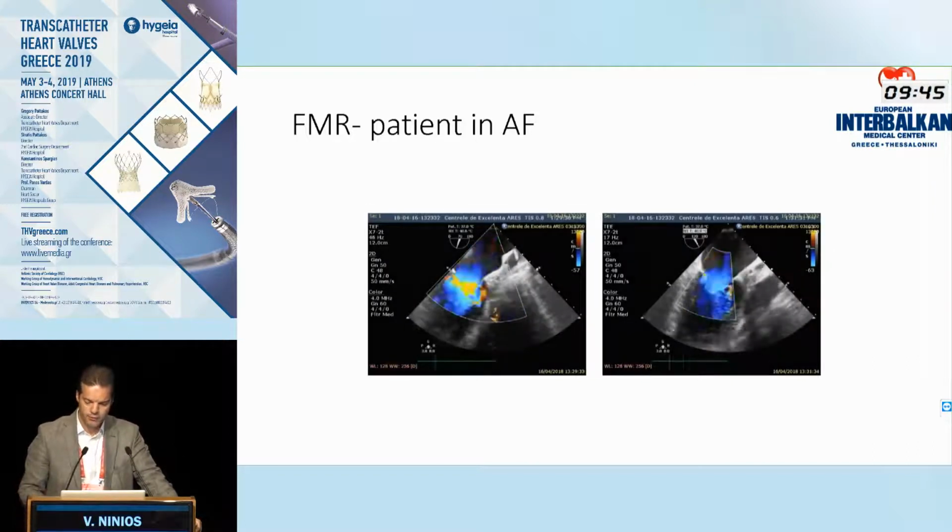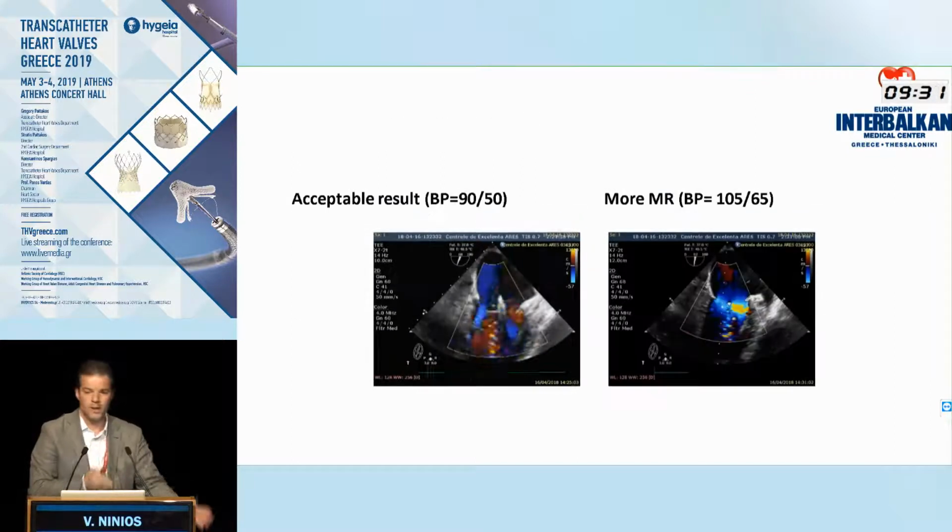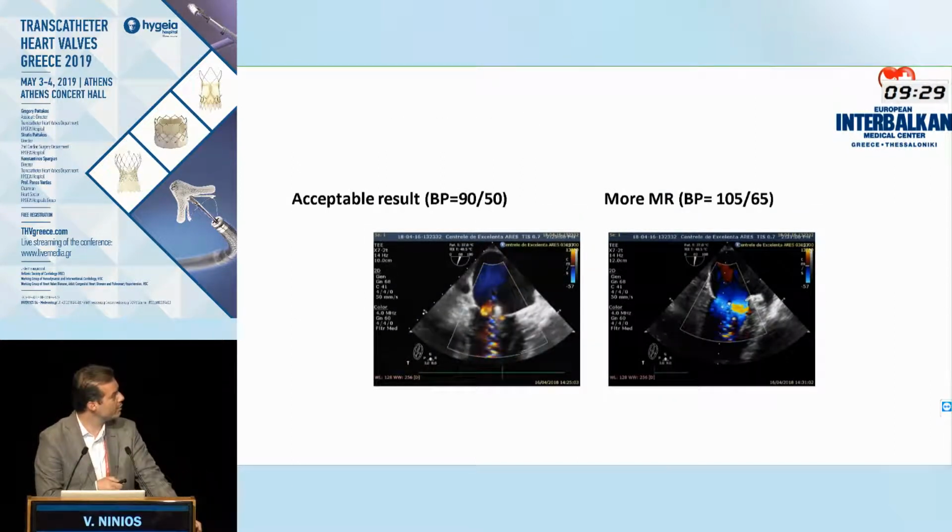But sometimes you have to think, because this is the beauty of this procedure. This is a procedure on a beating heart, on full hemodynamic loading. This is a patient with functional mitral regurgitation, atrial fibrillation. You can see on this commissural view, there's a broad jet. Okay, it's 1 clip, 2 clip. We put the first clip. Wonderful result. Look at that. We're happy. We can go. This is a 20 minutes procedure.